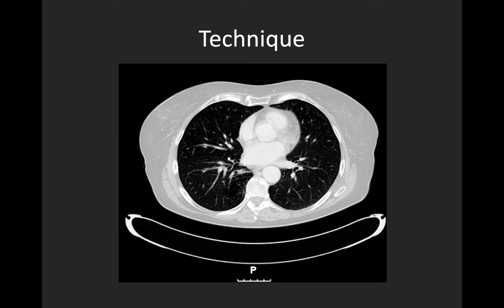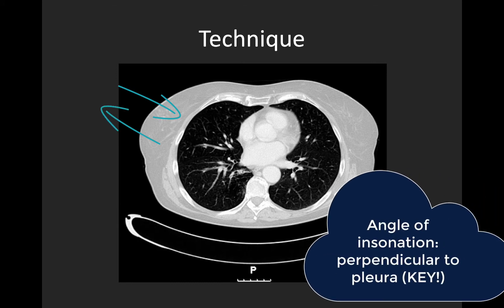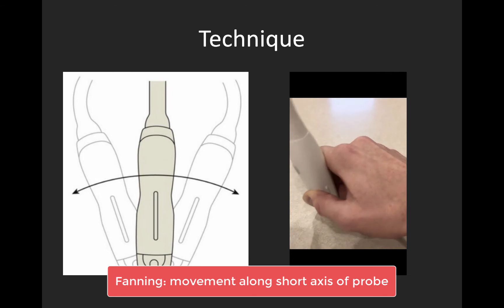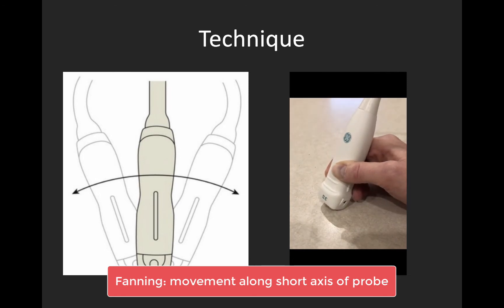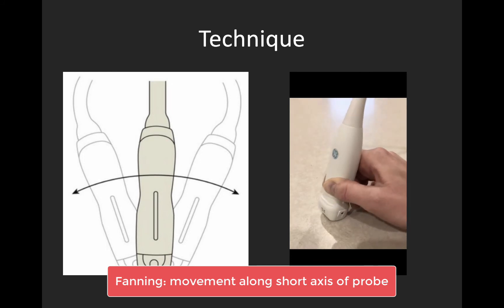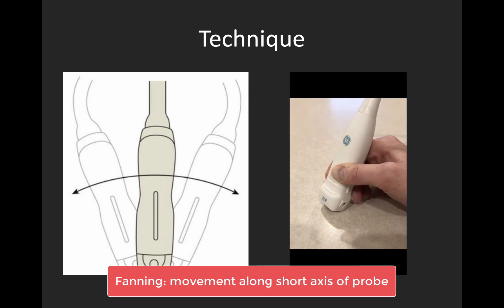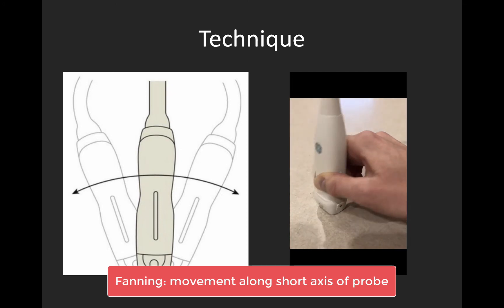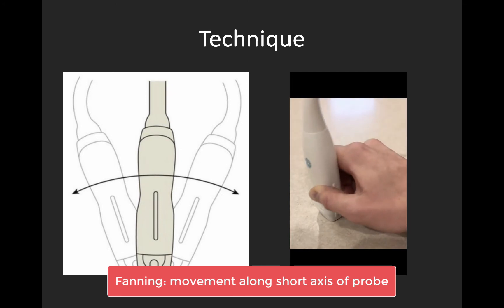The most important thing for technique is that we want our ultrasound beam to be perpendicular to the pleura. As you can see from the CT chest slice, the contour of the chest wall often doesn't match that of the pleura underneath it, so you'll have to employ what we call fanning or tilting. Fanning is movement in the short axis of the probe along a fixed point on the body, while changing the angle of incidence away from 90 degrees. As a common example, when scanning the anterolateral chest, you'll often need to fan your beam medially to find that perpendicular angle.